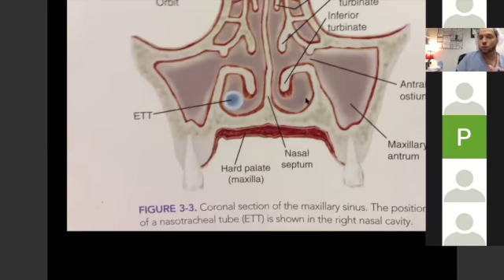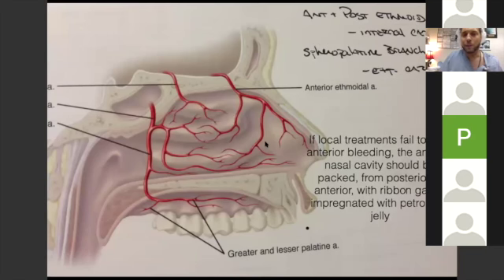So here's a look at the nose, right? So where are we putting our tube when we go through the nose? We're going under the inferior turbinate. And the blood supply is very prominent. There's the anterior ethmoid artery, which is off the internal carotid. There's sphenopalatine branch off the external carotid. And so topicalization with oxymetazoline is really going to vasoconstrict these guys and minimize bleeding. Another tip to minimize bleeding is to take a nasal trumpet, a small one, like a 28.